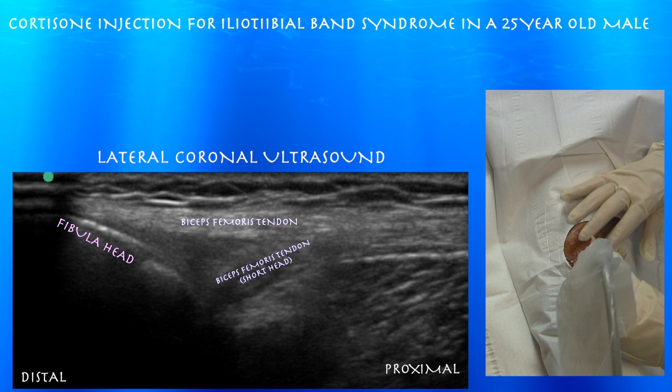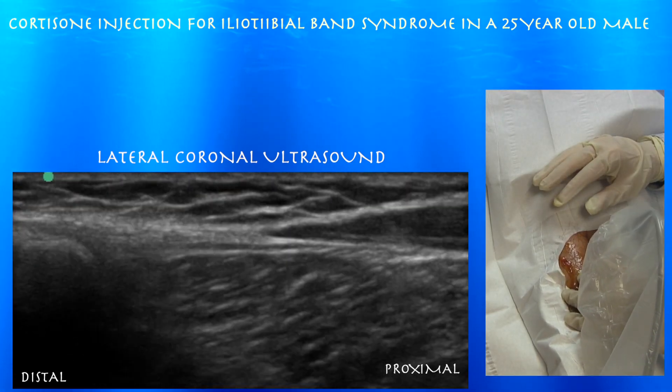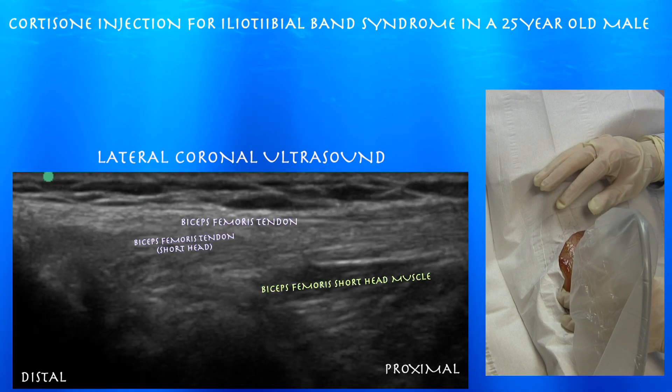Let's go into the fibula. Here you can appreciate the biceps femoris tendon, which has a dual insertion on both the fibular head as well as the tibia. Again here you can appreciate how that distal biceps femoris tendon has a dual insertion and bifurcates.